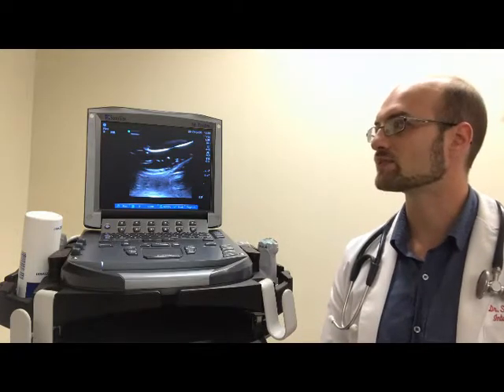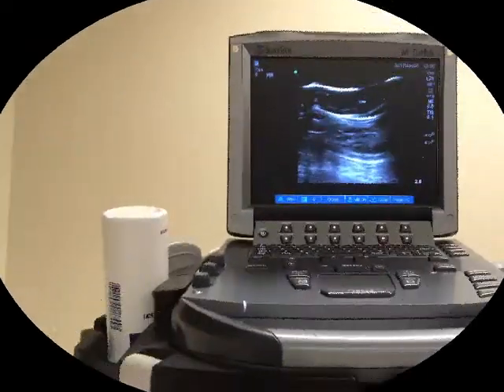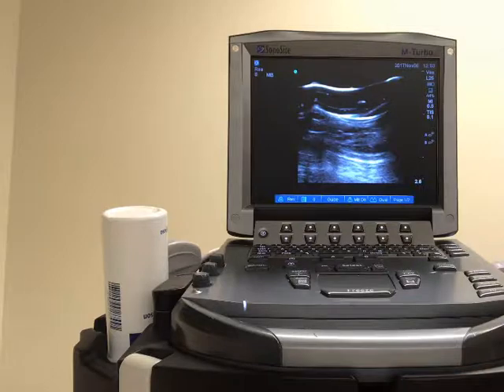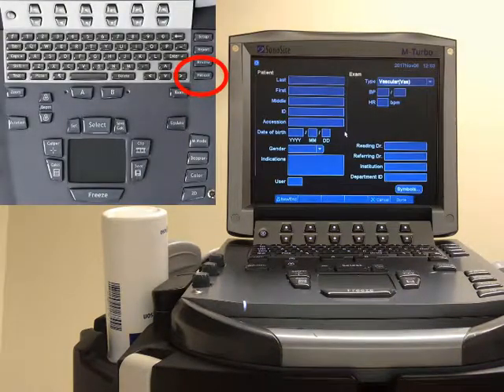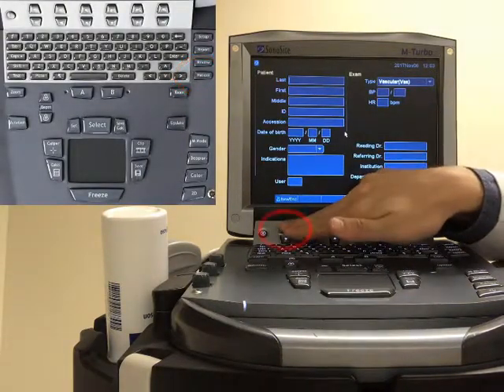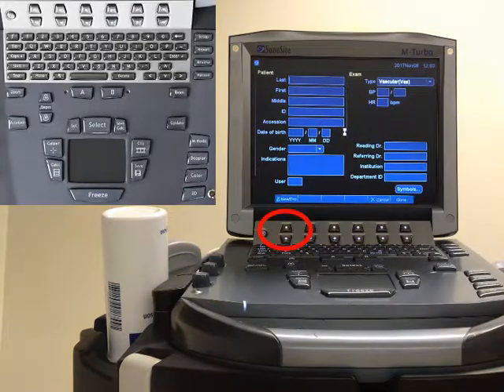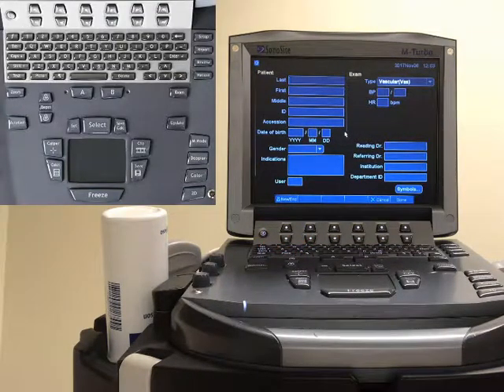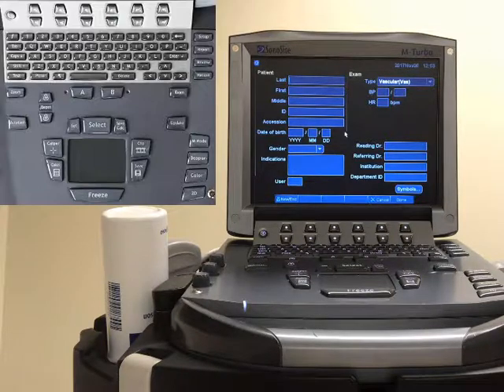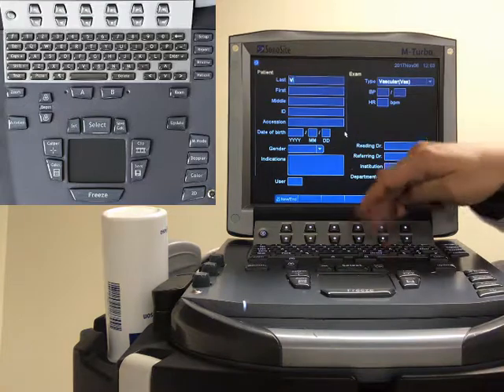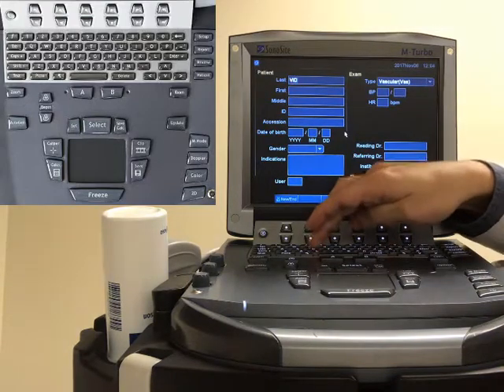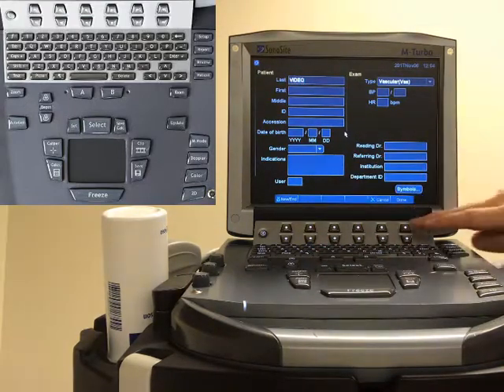Let's take a closer look. To start a study, simply push patient new or end, and in this screen you can enter in any patient information. I encourage you to put the indication as the name. In this case I will enter 'video' and then press done.